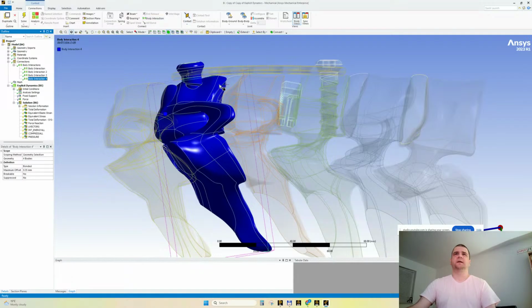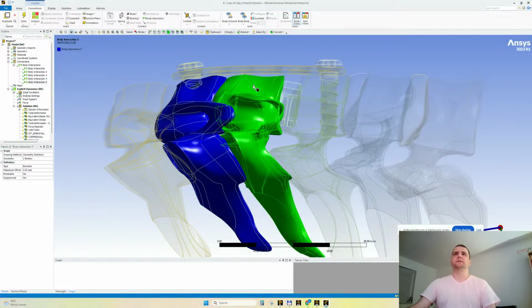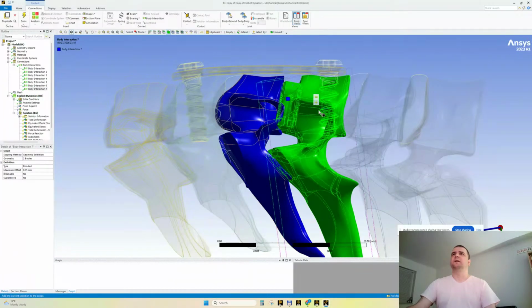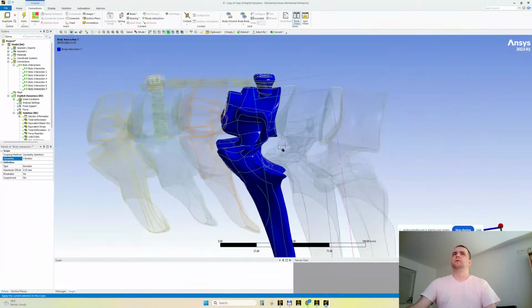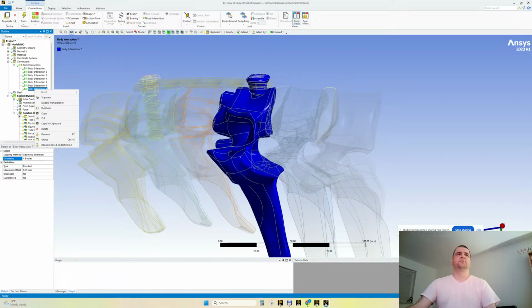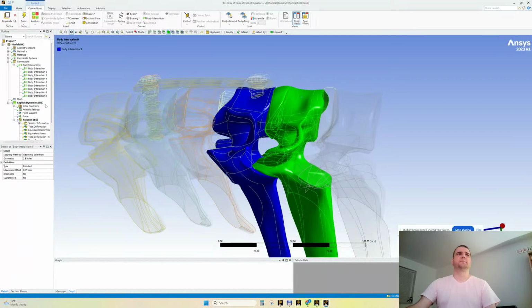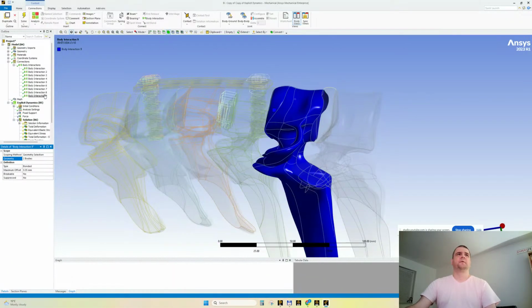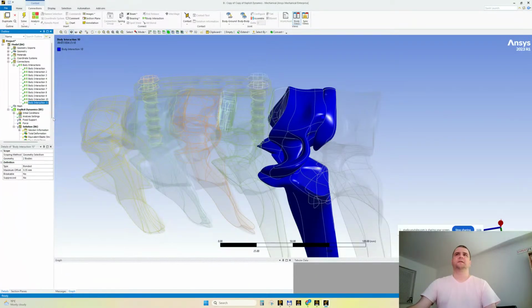So let's duplicate and here and this one. Let's duplicate this one and this one. Let's duplicate this one and this one. And the same, this one and this one, and the screws. All right, duplicate again, this one and the disc. Duplicate again, disc and vertebrae. One second. All right, I want to be 100% sure. Duplicate. And the last duplication.